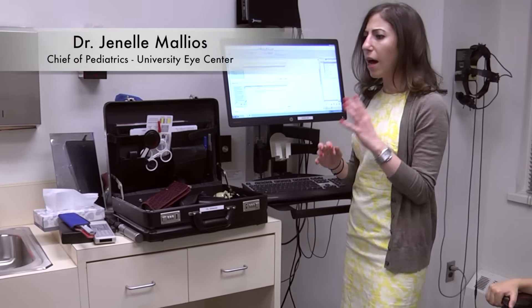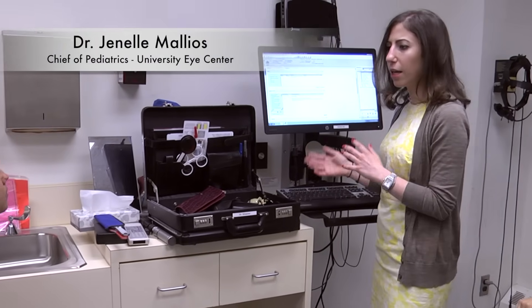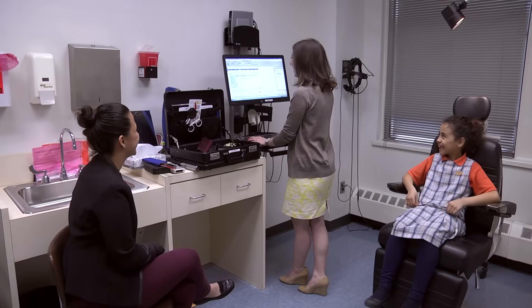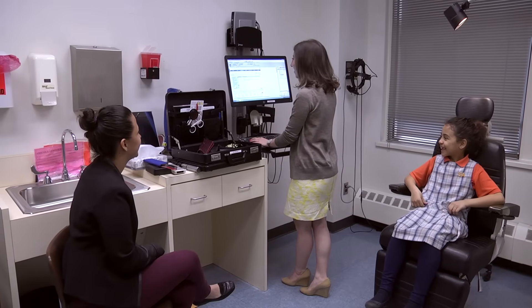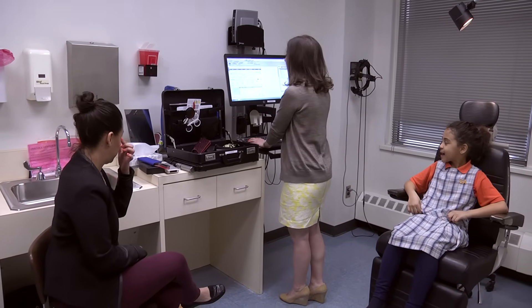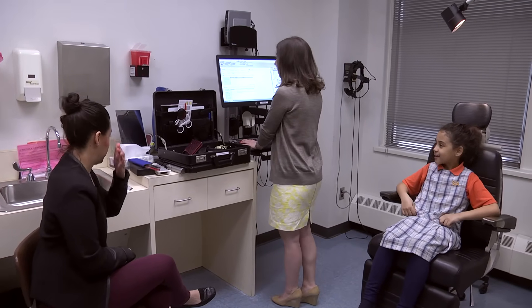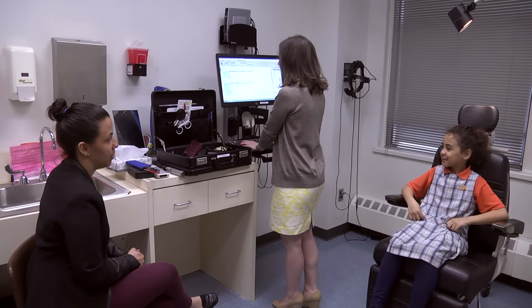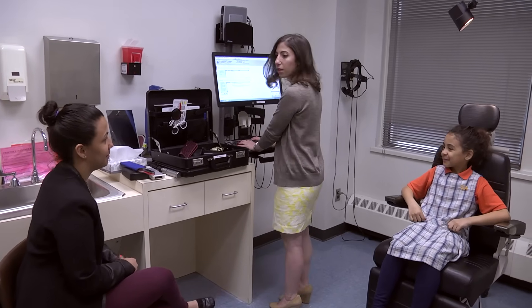The first thing that happens is a case history. We want to know why you and your child came in for the exam, what issues they may have, whether the teacher noticed something, or if there was a failed school screening. Any information is helpful.